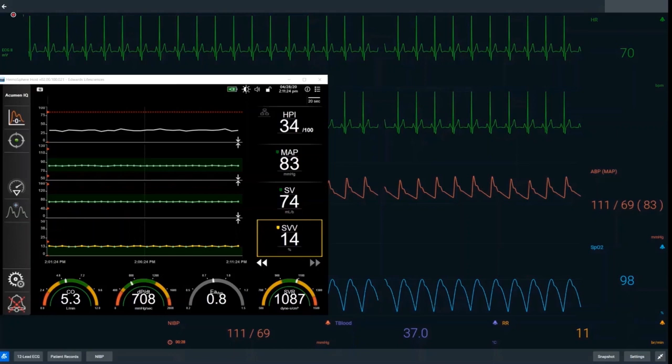In the middle, we have our invasive blood pressure taken from a radial arterial line showing our systolic, diastolic and mean arterial pressures. At the bottom, the blue line is our pulse oximeter showing our saturations. The monitor in the foreground is our advanced haemodynamic monitor with the Acumen software.